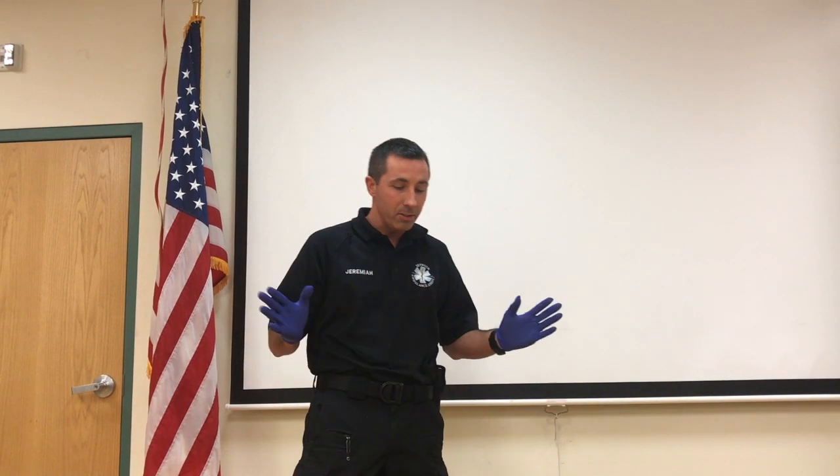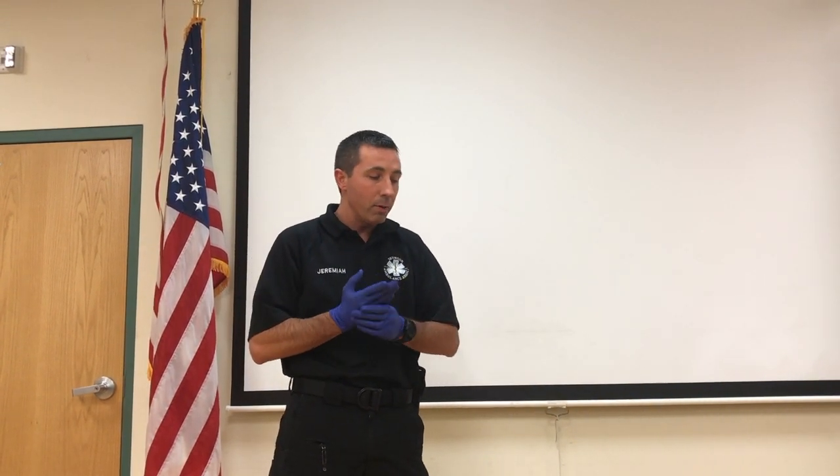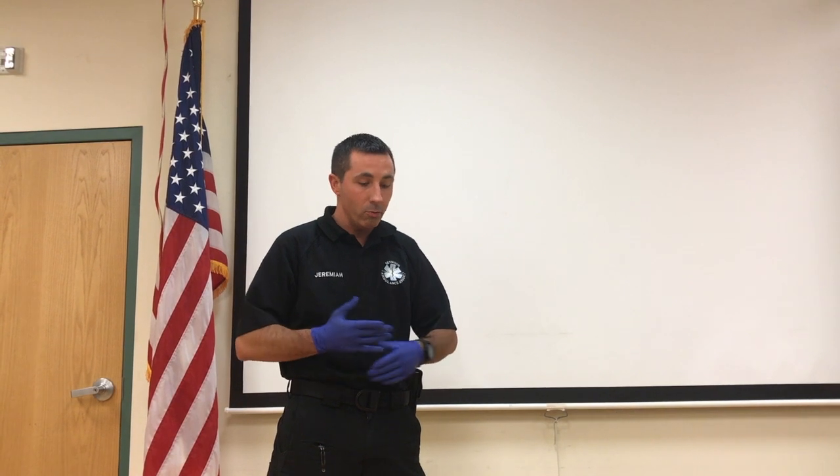You respond to a call and find this patient lying on the floor. My BSI is on, I'm checking to make sure my scene is safe. Upon arrival, I am going to ask bystanders or witnesses if they can tell me what happened. There are no bystanders around, so nobody can tell me anything about the arrest events.